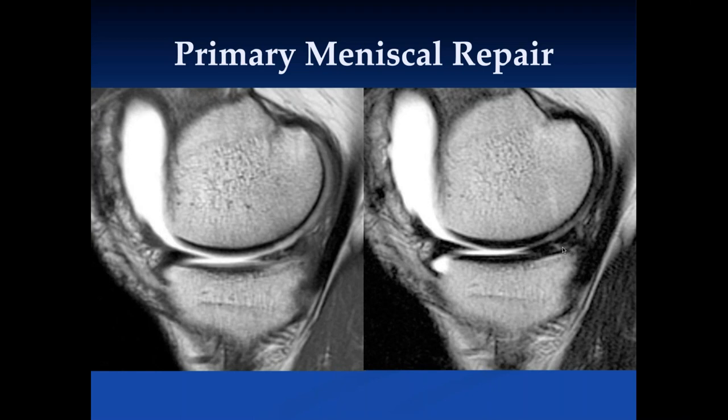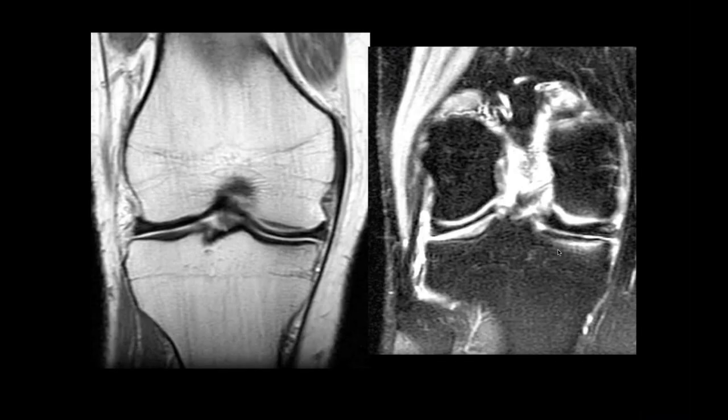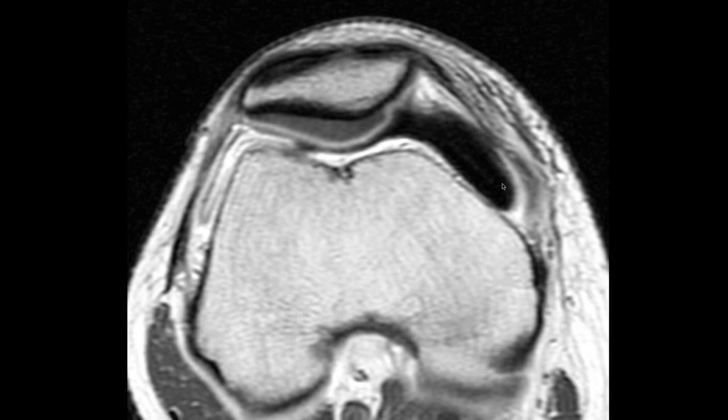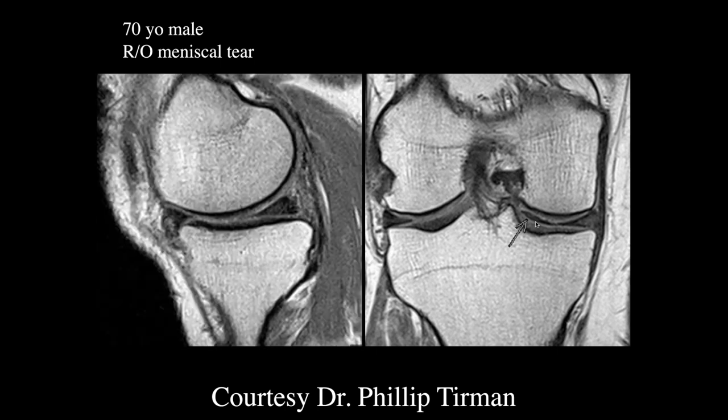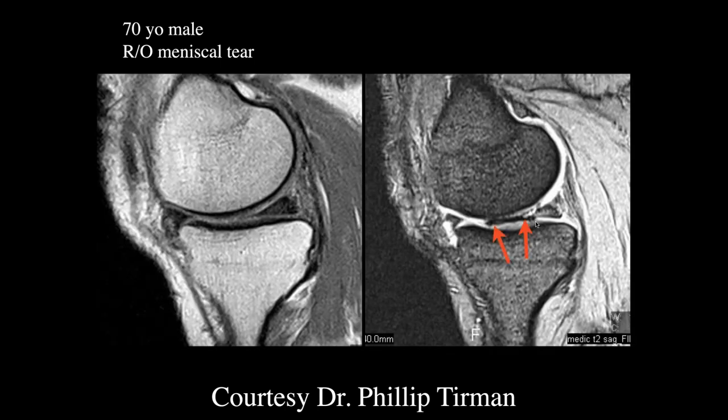Here's another case of primary meniscal repair where the signal is not as bright as contrast. One concern: in this patient with MR arthrography, we can't see the free edge of the meniscus very well because the contrast is very dark. This was by mistake a 2-to-1 dilution of contrast — it should be a 200-to-1 dilution — and therefore it's de-phasing the signal, producing signal loss rather than enhancement.